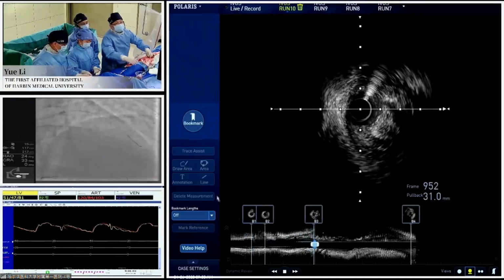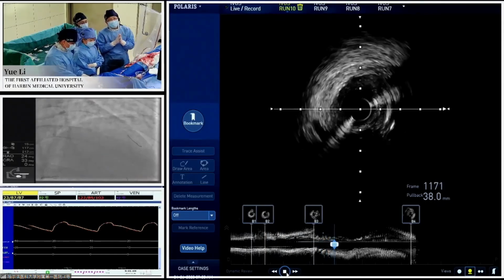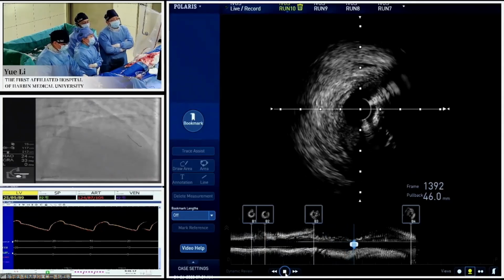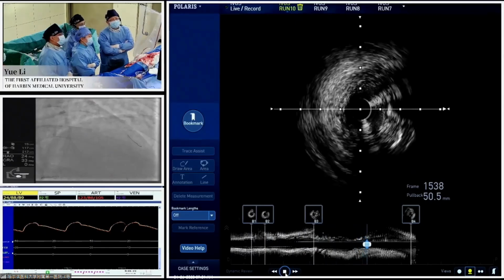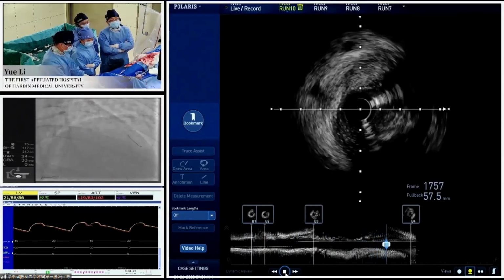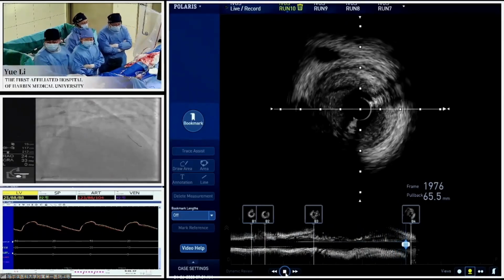So most of the segments were in the true lumen. Yes. The proximal portion of the two wires were in the same layer. How to keep the diagonal branch patent? I'm not quite sure if we need to put the catheter in the diagonal to double check that the bifurcation is good. I think maybe we should use the balloon, the jailed balloon technique, to protect the diagonal branch.